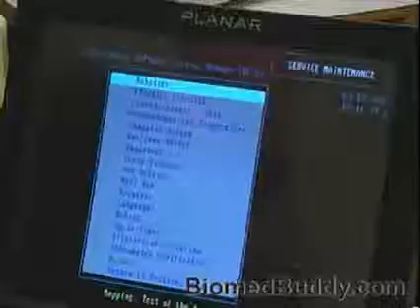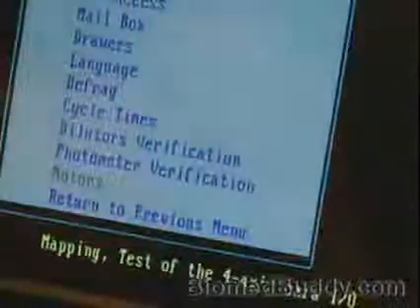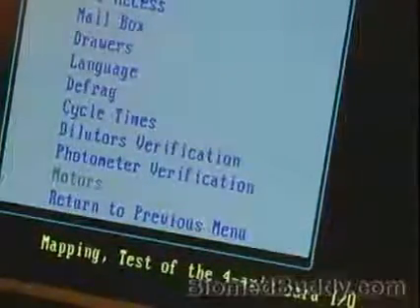By chance, if you just looked at the endurance, you saw I had a bent needle. We're going to go through mapping in order to try to correct that. Okay, I backed out, I'm still in the service. I'm going to go into the robotics. Robotics, down to mapping.